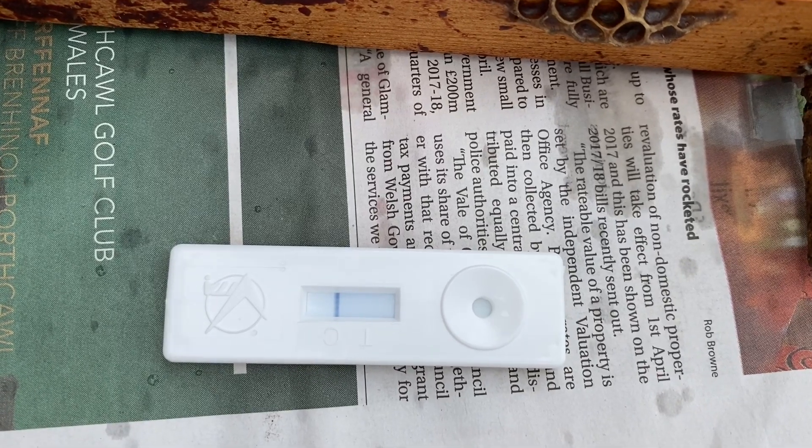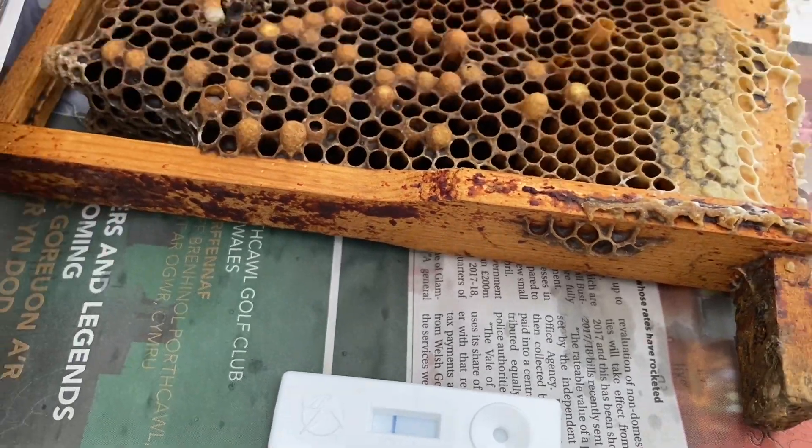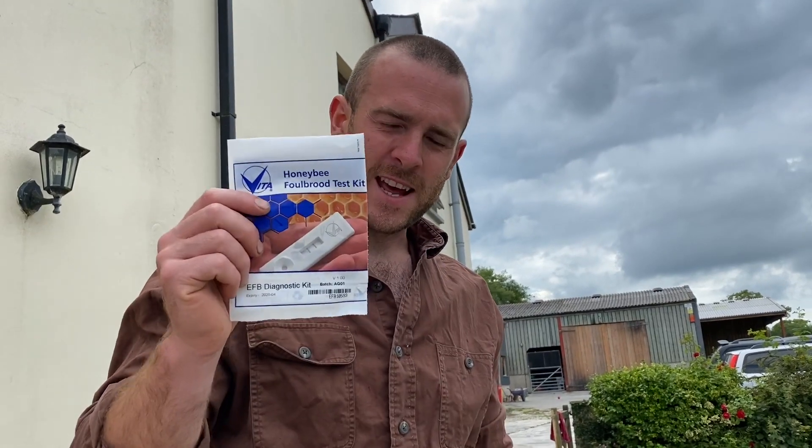So that was a negative — good news, this frame or hive didn't have fowl brood. But it's always worth checking. Sometimes stuff can look like fowl brood and it's not.